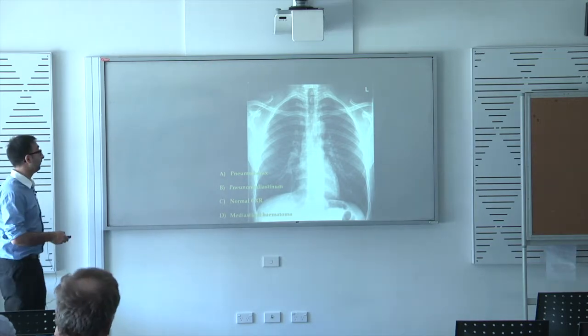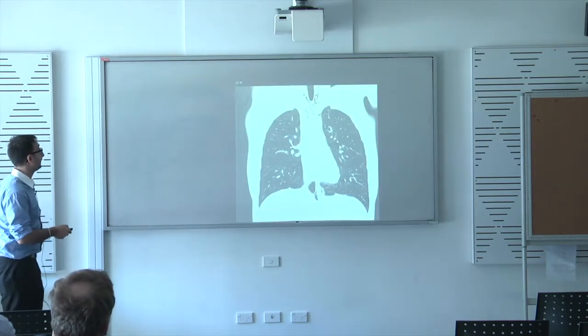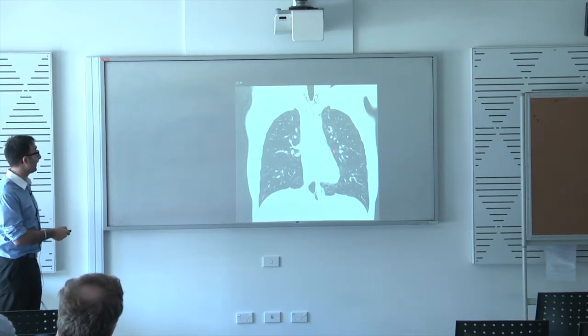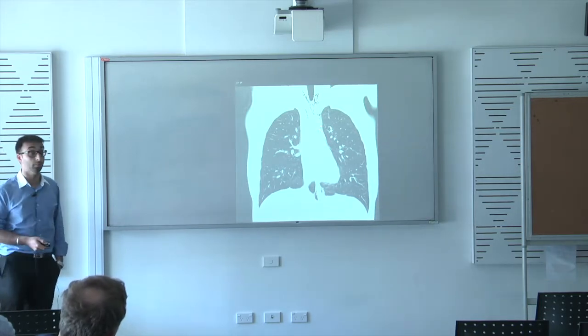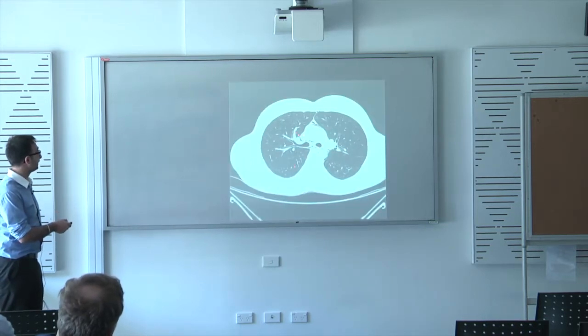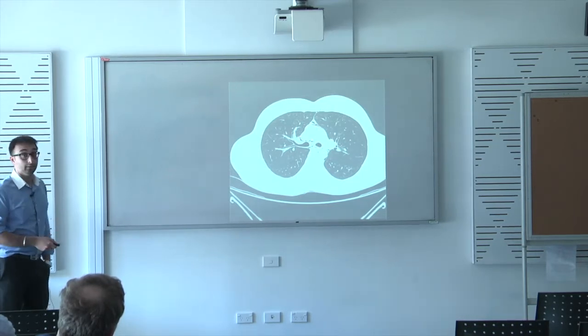And just to confirm, they had a CT, and this helps delineate further. You can see there's all this ectopic gas up in the neck, and then there's that little thin linear lucency stripping through here, and that's what you're seeing on the plain film. And just to show you that, you've basically got gas here, and it's in the mediastinum along the front, and this goes on to the.